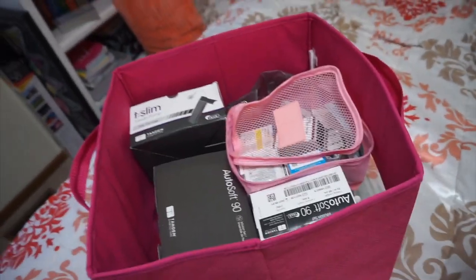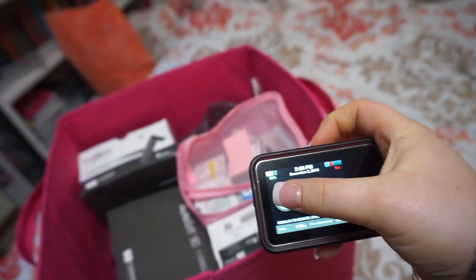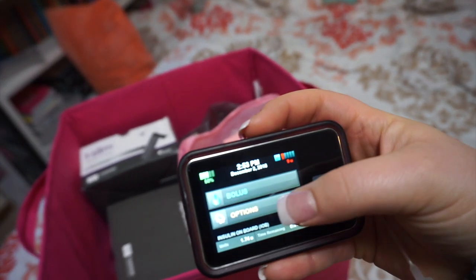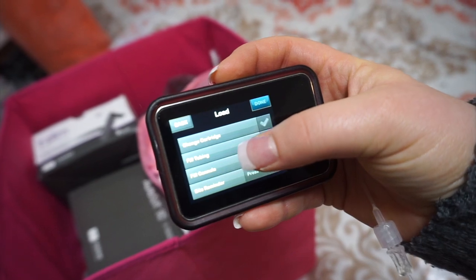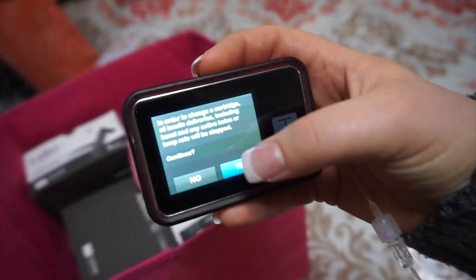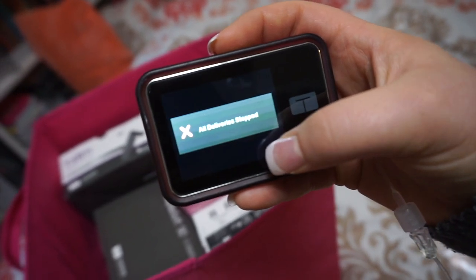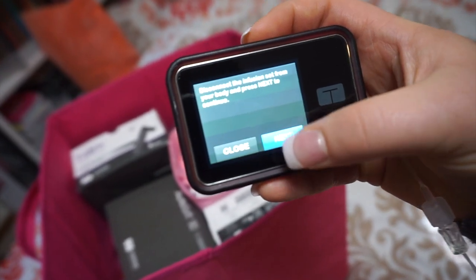Without further ado, let's get into it. The first thing I do is follow the prompts on my insulin pump. I have the T-slim pump, so whenever I need to change my pump I go into Options, then Load, then Change Cartridge. It gives you the instructions there — I have to stop the insulin delivery and then disconnect from my body, so I push Next.